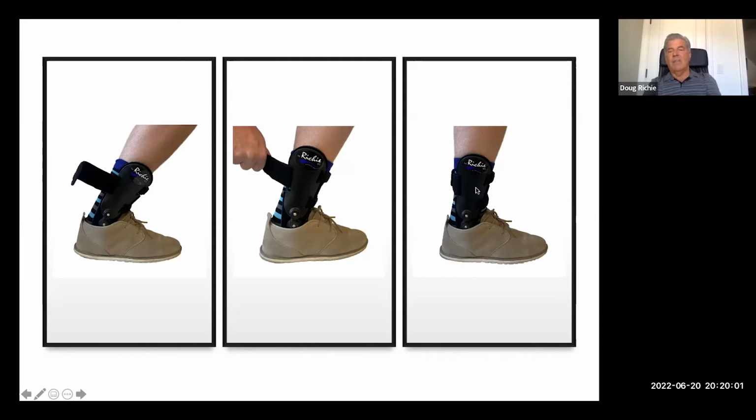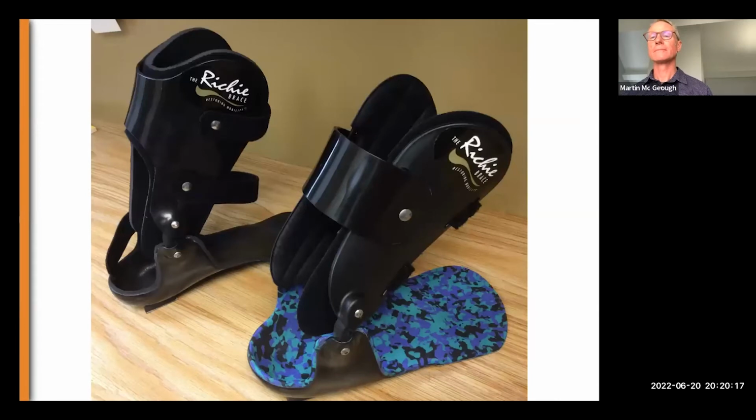And this really loads the brace and loads those hinges, and we cinch that strap tight. And now when we stand upright, these hinges are fully loaded and the limb uprights are perfectly aligned to the leg. If we let these limb uprights slip forward, we're going to lose some of the dynamic recoil of the dynamic assist brace. We can add more posterior stability to the brace.